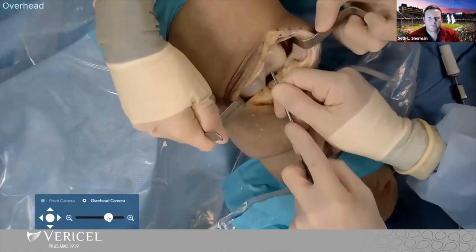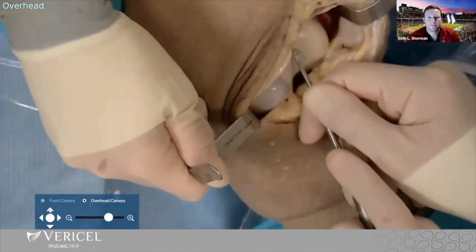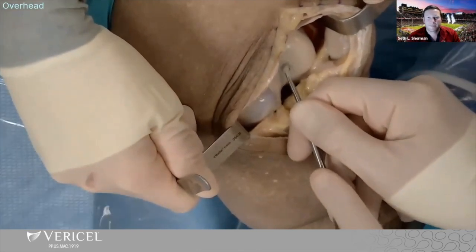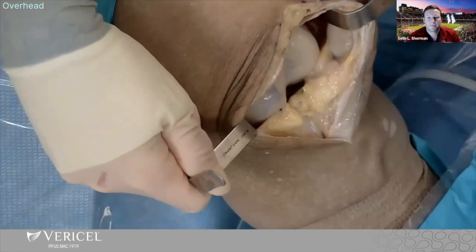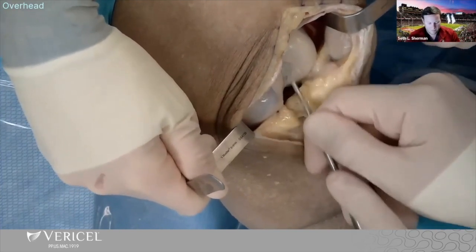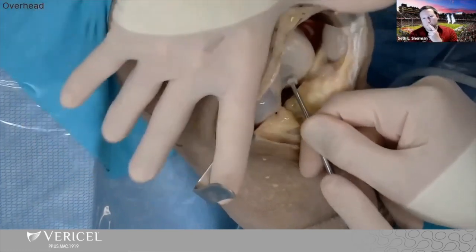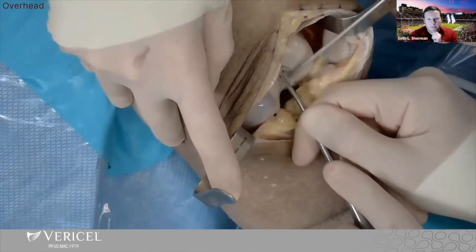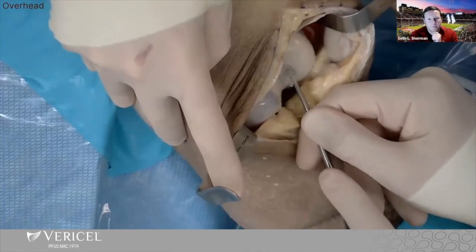The key is right along the border. We're trying to get into the calcified cartilage layer, which is the white layer. After the first few MACIs, you start to get the feel for it. It's really not just a single scrape and dig — you want to have that long sweeping motion. You can see we're doing that long sweeping motion, taking off the cartilage. On the cadaver it's a little harder. You can see that shiny white layer — that's the layer you want to get to. That's the calcified cartilage layer, one layer above the subchondral bone.